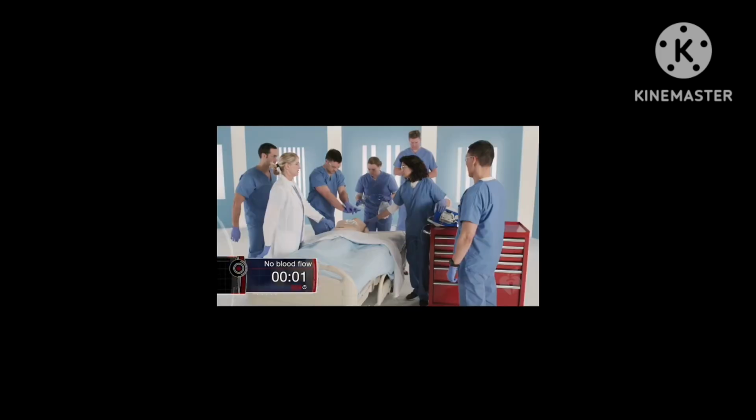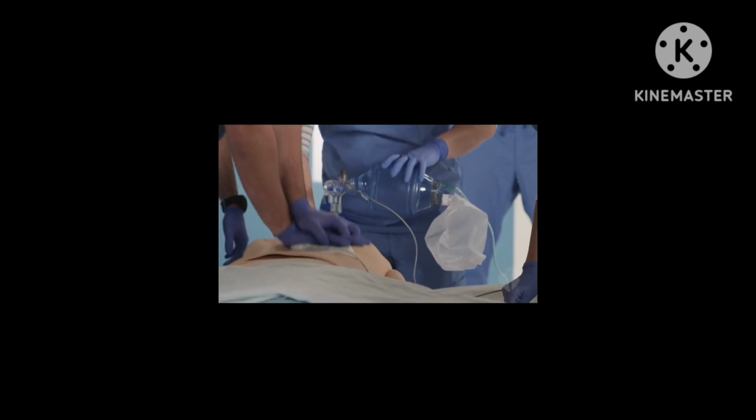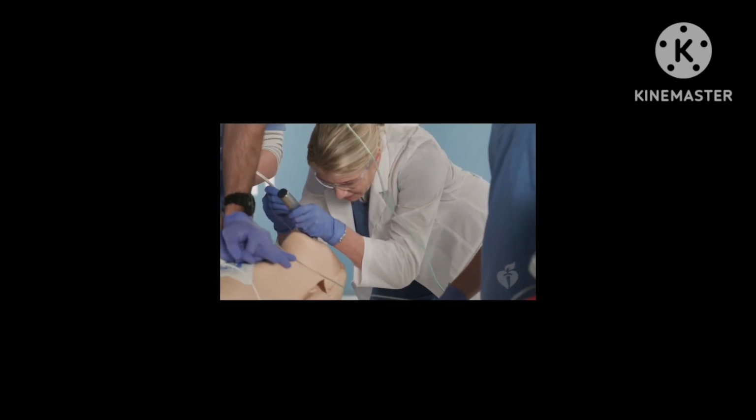Switch. Okay, go ahead and chart and shock. Clear. Shock. Resume. Except for intubation. Intubation should be performed by skilled providers, ideally without stopping compressions.